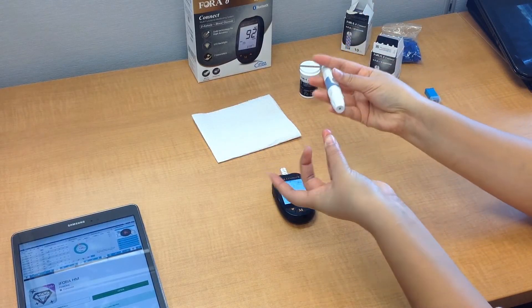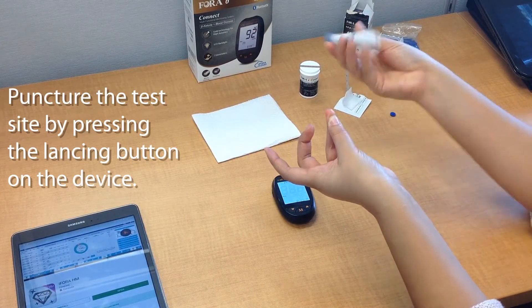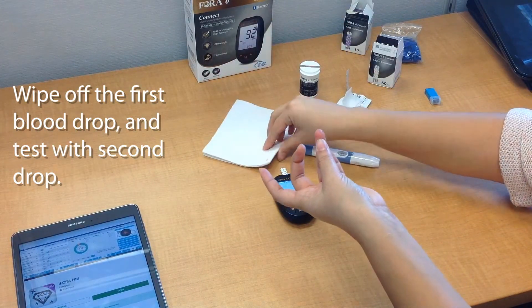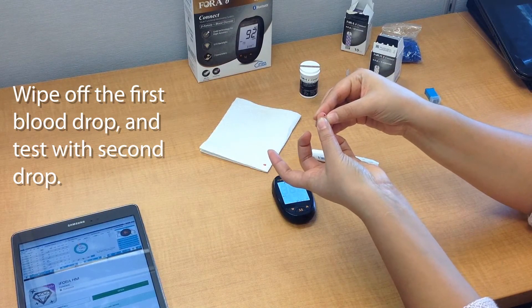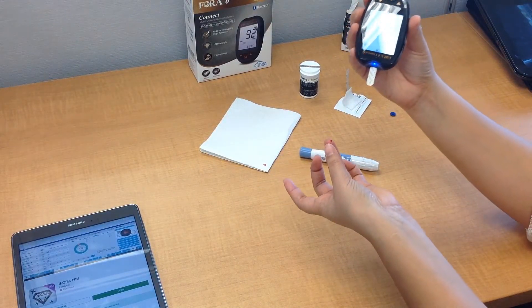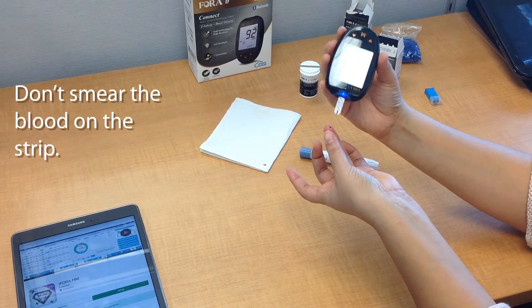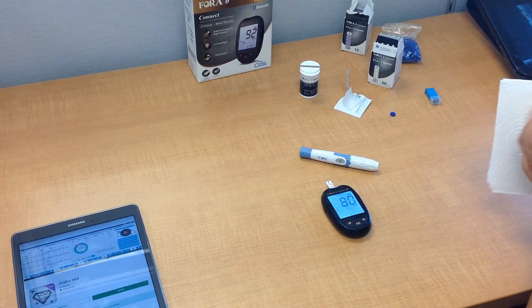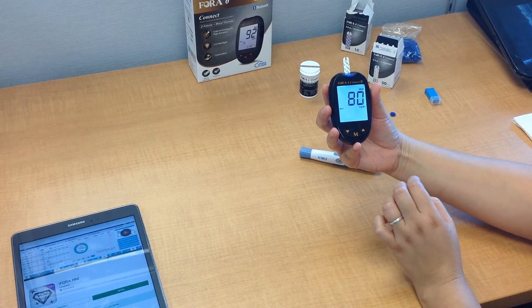Now go ahead and push up — you can see it's nice and red. Take the lancing device and press. The blood will come out — clean the first drop because there can always be a risk of contamination and you want your test to be completely accurate. Then press again and once there's enough blood, take the meter with the strip at an angled position to make sure that it absorbs the blood, and try not to smear the blood on the test strip.